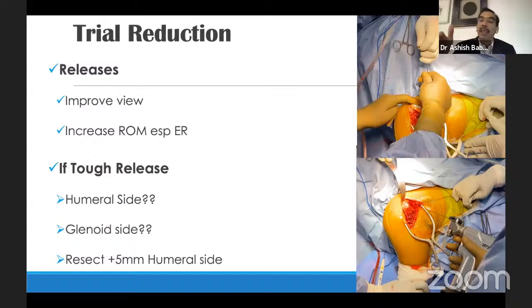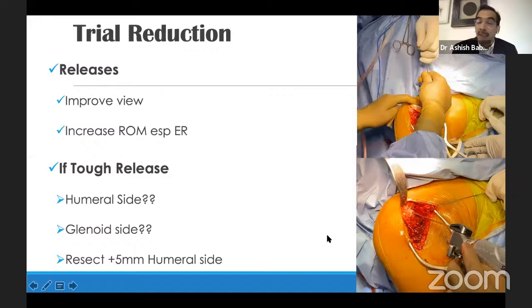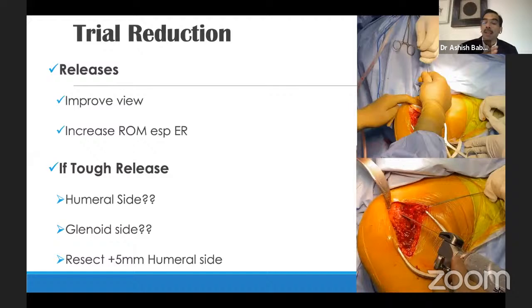If still that doesn't work, then go on the glenoid side at 6 o'clock, release some of the anterior inferior tissues between the 5 o'clock and 6 o'clock position. And if still tight, then you go back and perform a humeral recut. That's about 2 to 5 mm, and that should be enough. You don't want to do too much. It's always better to do a conservative humeral resection and then augment it with another 5 mm cut as such.